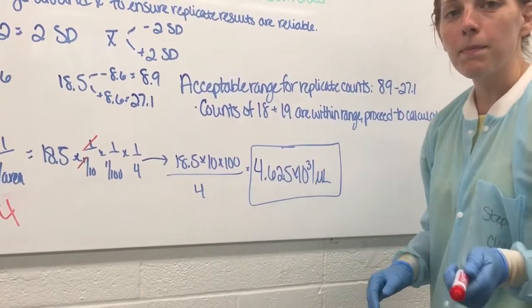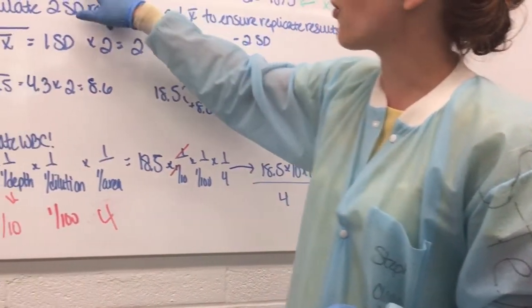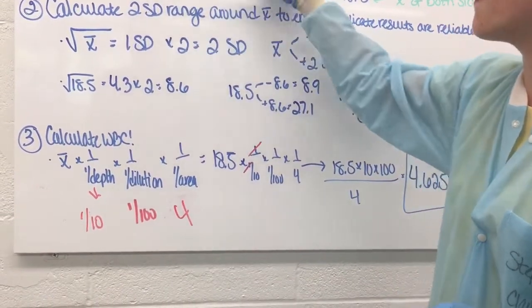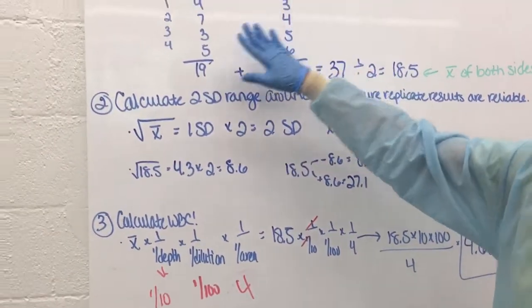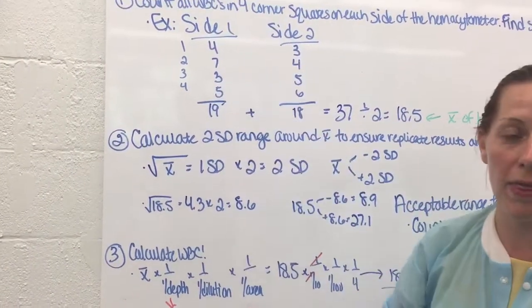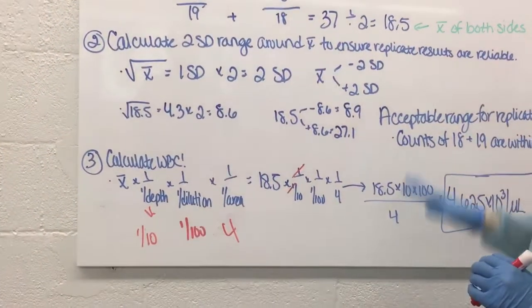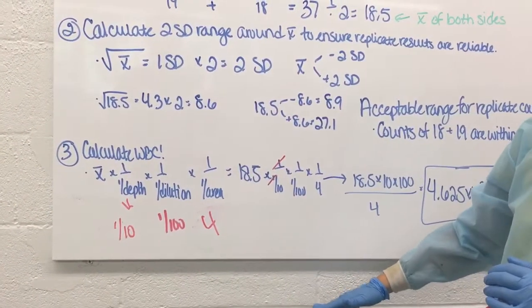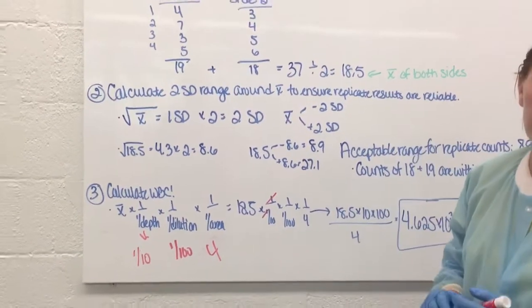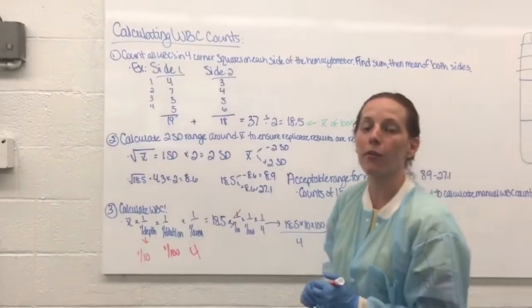But this is important because you should know that when you do your counts in lab, your counts on each side should be coming out somewhere in this area. They might be a little bit higher than that, and that would be good, but they should not be lower than this. So that's how you're going to calculate this stuff. You need to make sure that you can do this from soup to nuts and that you understand why you're doing it before you come to lab this week, because I can guarantee you that all of this is going to be a part of your quiz.